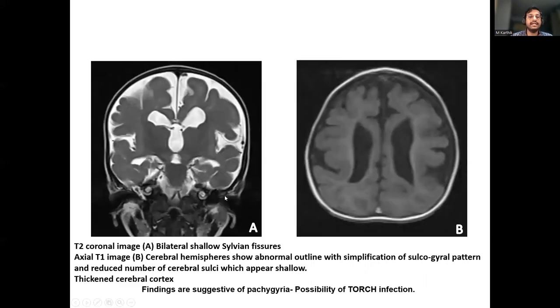A T2 coronal image shows bilateral shallow sylvian fissures, and an axial T1 image shows cerebral hemispheres with an abnormal outline, simplification of the sulcogyral pattern, reduced number of cerebral sulci appearing shallow, and thickened cerebral cortex — findings consistent with pachygyria.